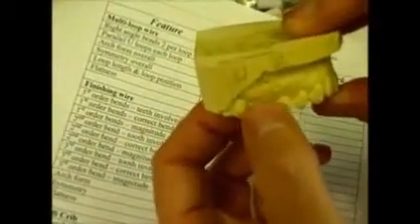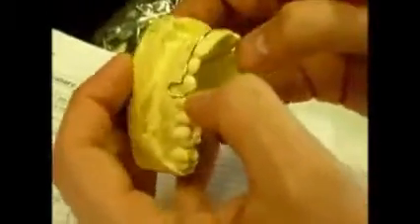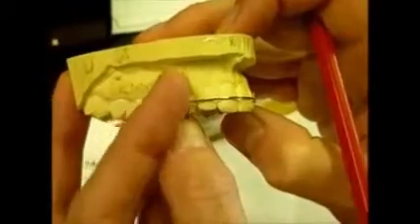I try and find one with fairly big molar teeth, because if you try and make them on very short teeth, it's really hard to bend. So I usually try and find one with big teeth, or biggish teeth, and reasonably straight. So we look at that, then we look at the loop height for these loops, and they need to be long enough to have some flexibility in them for adjustment.